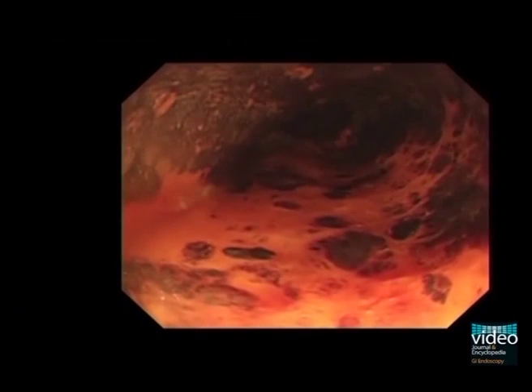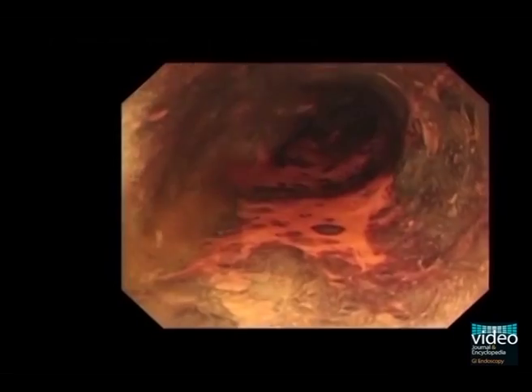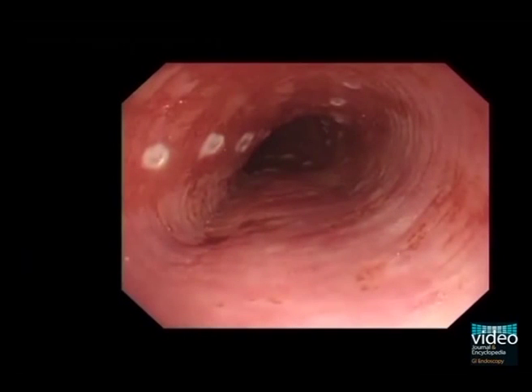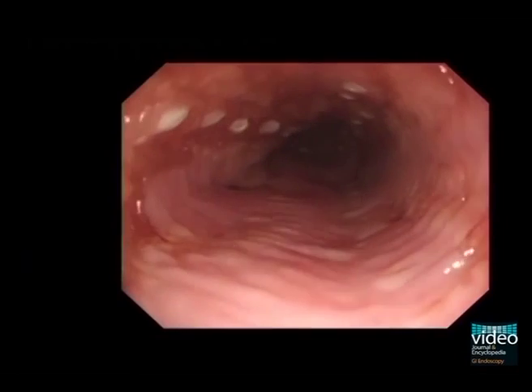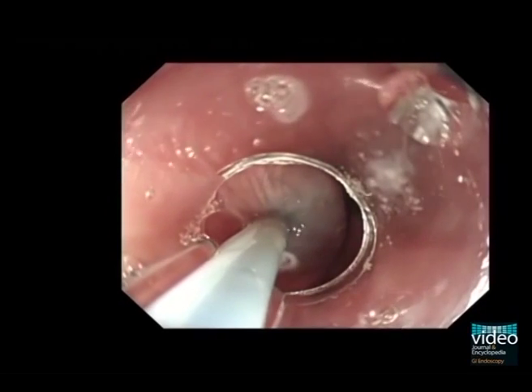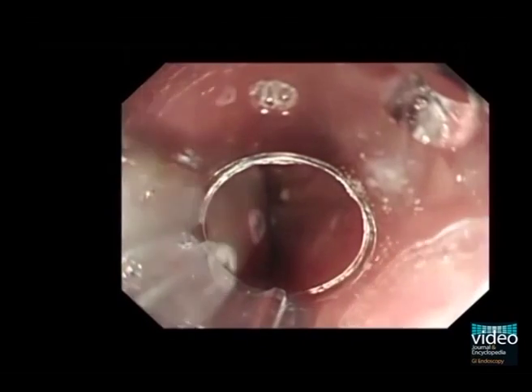A 73-year-old male was referred for treatment of esophageal squamous cell carcinoma. After performing iodine staining to identify the margin of the lesions, marking dots for the incision were placed outside the margin with a flex knife. An electrosurgical current generator was set at 80 watts in soft coagulation mode, effect 5. After marking, sodium thiosulfate solution was sprayed to relieve symptoms caused by the iodine solution applied previously.